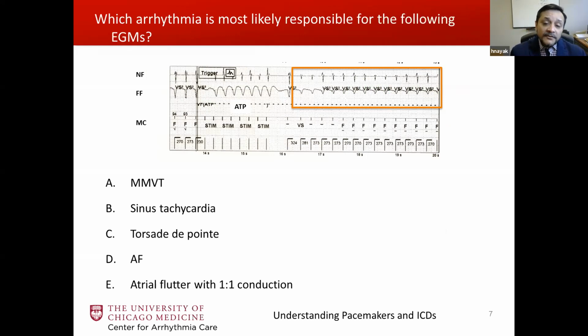Basically what we're looking for are changes in the inscription of the electrogram, to say that the electrogram looks different from what we see in sinus rhythm. The challenging part of this case is that the electrograms don't seem to change that much. Well, let's go over that. What we're going to try to do now is correlate the rhythm strip that was recorded at the time with the stored electrograms to highlight some important features.